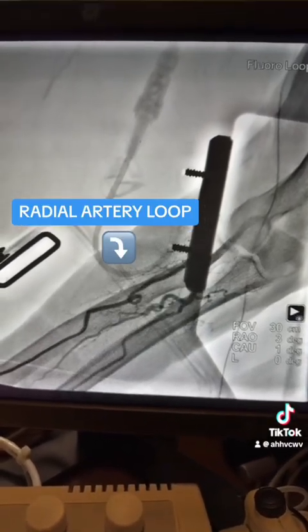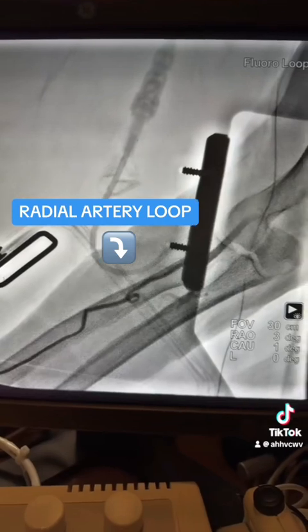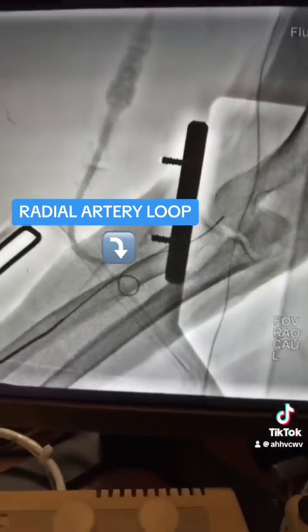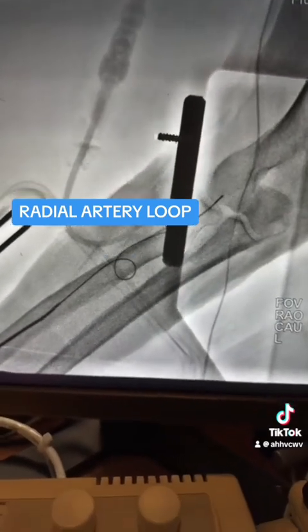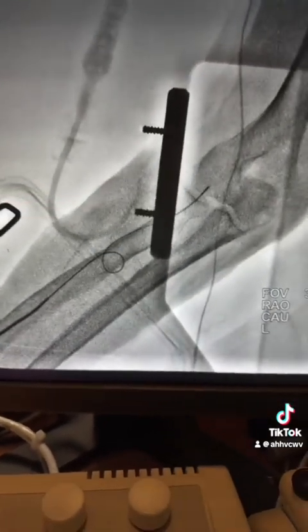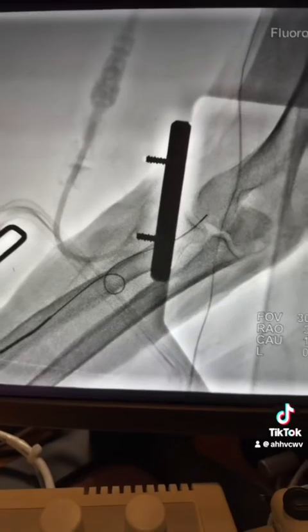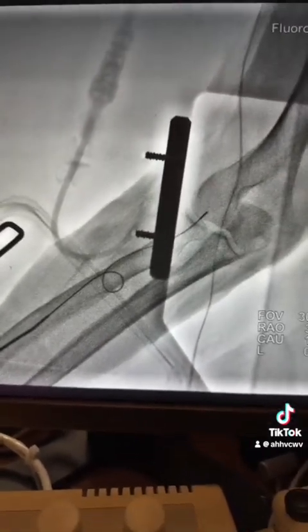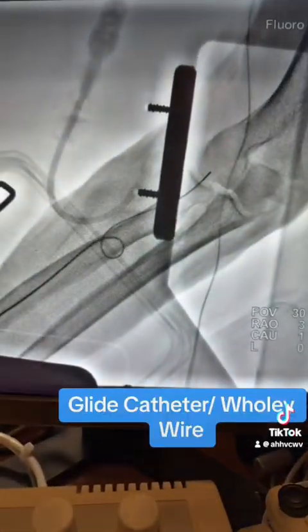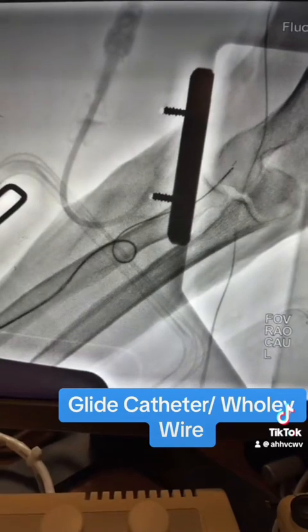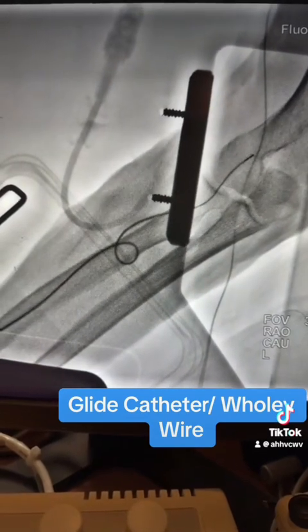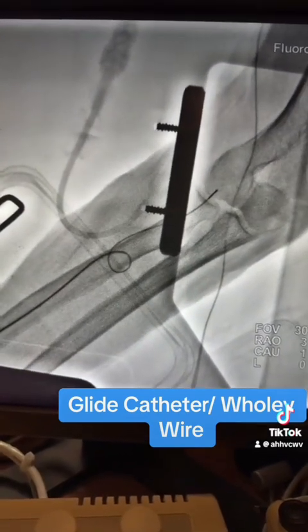Pull the wire and use the workhorse wire — the workhorse wire did not pass through. So I have to advance the Glidecath, as you see here, making the loop slowly, and then advance the wire.